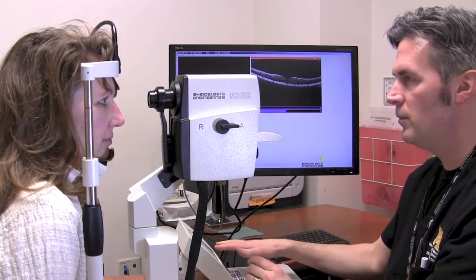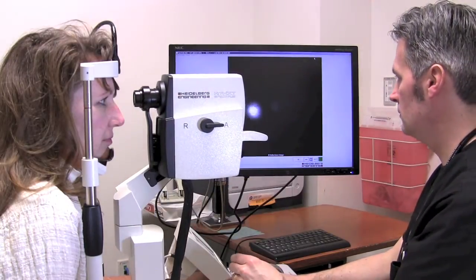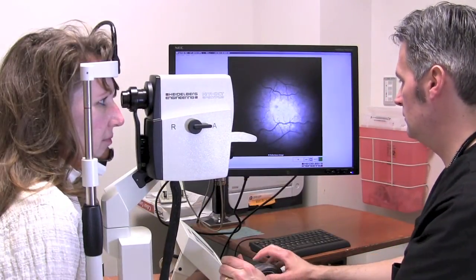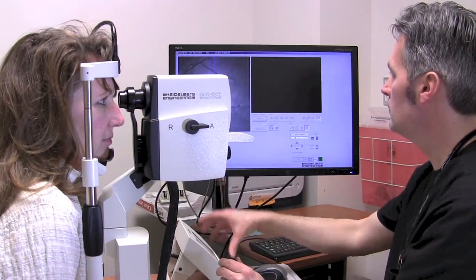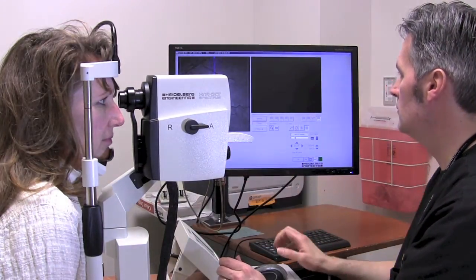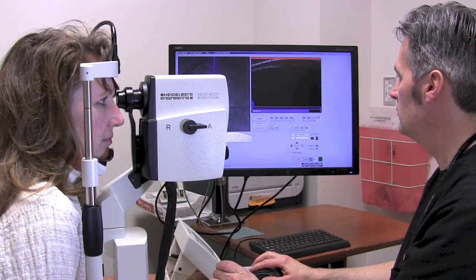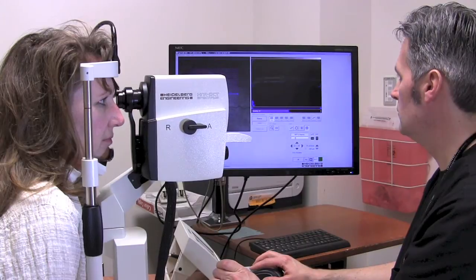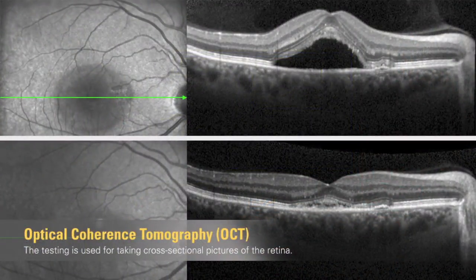First is Optical Coherence Tomography, or OCT. It produces images of the different layers of the retina, choroid, and optic nerve. These images will help your physician detect diseases such as macular degeneration, diabetic retinopathy, glaucoma, and optic neuritis. In this OCT image, the different layers of the retina are represented by bands that appear in various shades of gray.